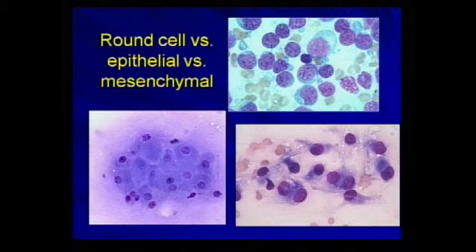When you're looking at mesenchymal neoplasms, as we see in the bottom right-hand corner, these cells are usually spindle-shaped, and they tend to exfoliate very poorly. So these will be the most paucicellular of the three. They're usually locked into a bit of matrix. Okay? They often are closely associated with each other. But look at the tails here. And there are a couple of things as we get into mesenchymal tumors that those tails will tell you.